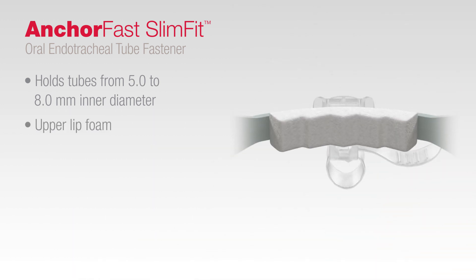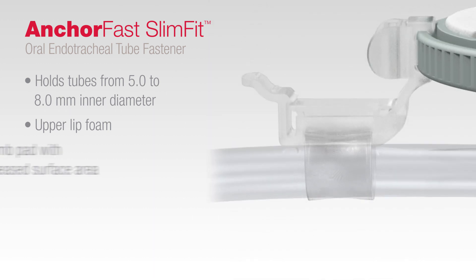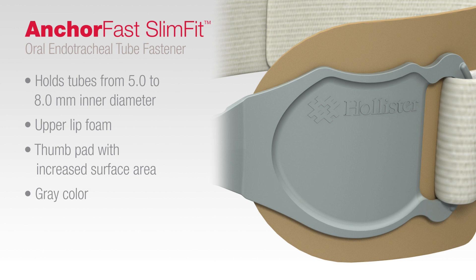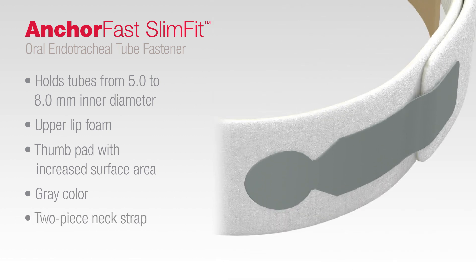It has an upper lip foam designed to increase surface area contact. It also features a thumb pad with increased surface area for finger or thumb placement when opening. The gray color helps differentiate AnkerFast Slim Fit with other products in the AnkerFast family. The two-piece neck strap provides secondary securement designed for adjustment at an accessible area on the patient's head.